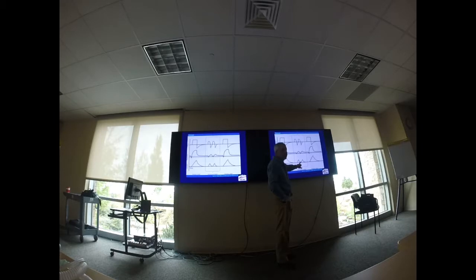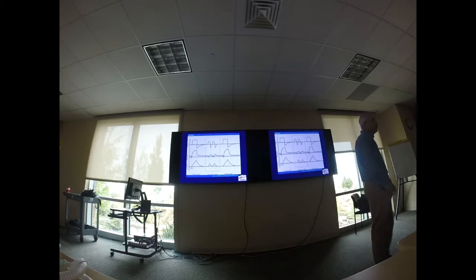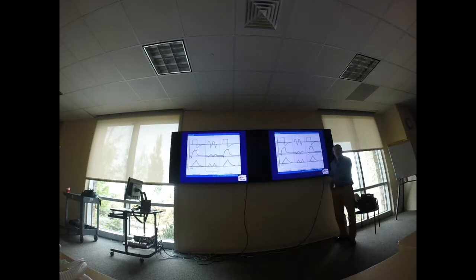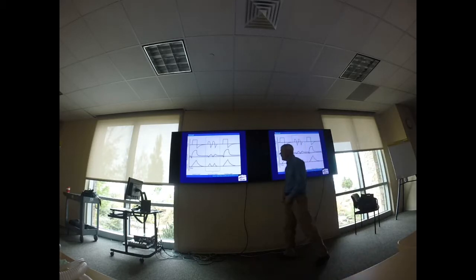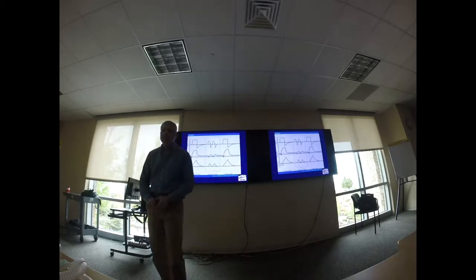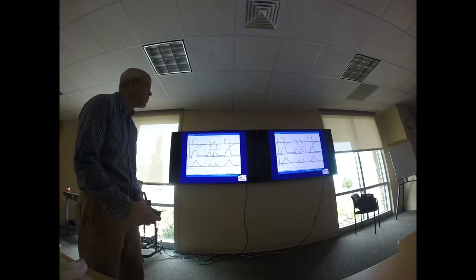right there, all right? But he doesn't have any pressure support associated with this breath right now, so he's having to fight that whole vent circuit to do that. So you can understand where the patient could tire out a little bit with this, can't you? Because he doesn't have the ability to not fight all that circuit. You've got all that dead space, that endotracheal tube, and all that dead space attached to him. So right there, he does not have any pressure support associated with it.